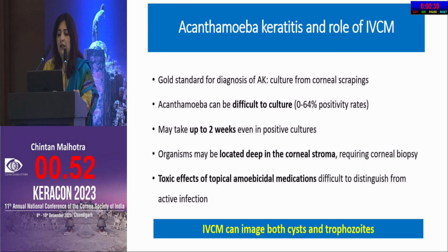So the important thing is that in acanthamoeba and fungal keratitis, IVCM has a broad role, because where we cannot get the cultures or the lesions are deeper, we get a direct imaging at the first go itself. Even in positive cases, cultures may take up to 2 weeks. And like I mentioned, those lesions located in the deep stroma cannot be accessed unless one goes in for a biopsy or other invasive procedures.